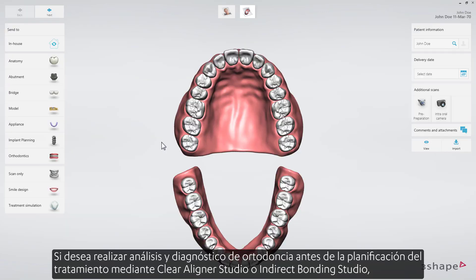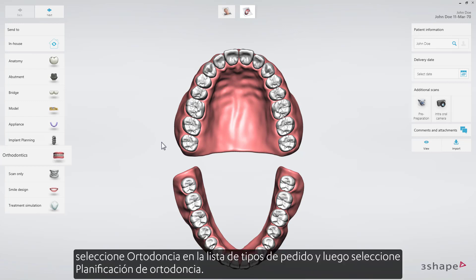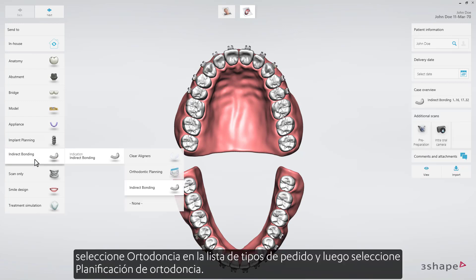If you want to perform orthodontic analysis and diagnostics prior to treatment planning using Clear Aligner Studio or Indirect Bonding Studio, select Orthodontics from the order type list, and then select Orthodontic Planning.